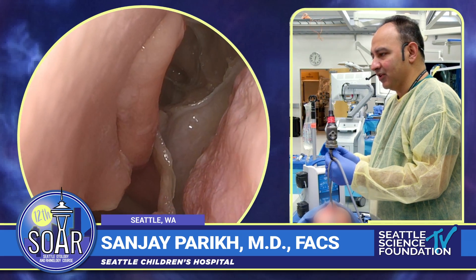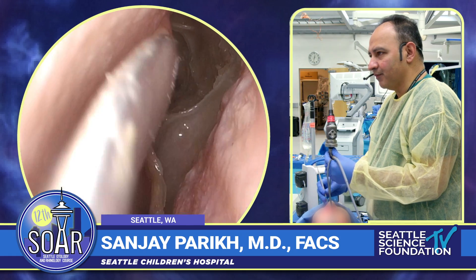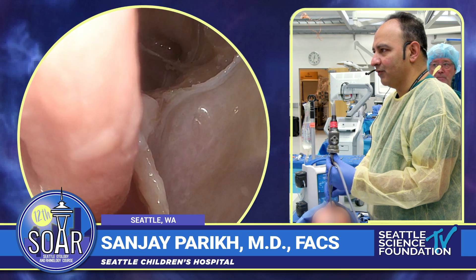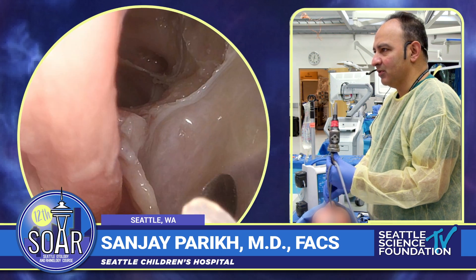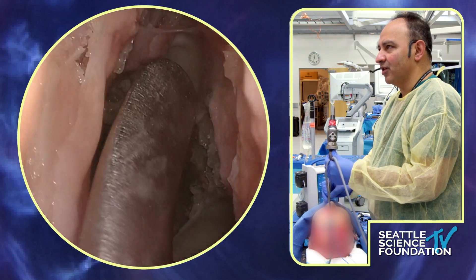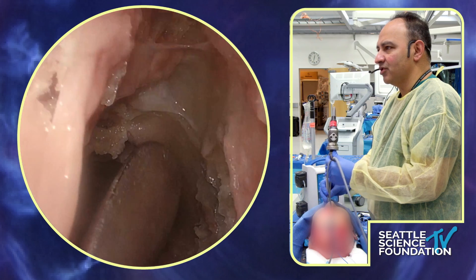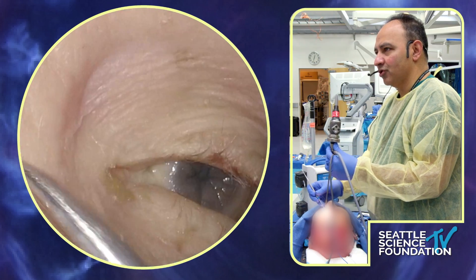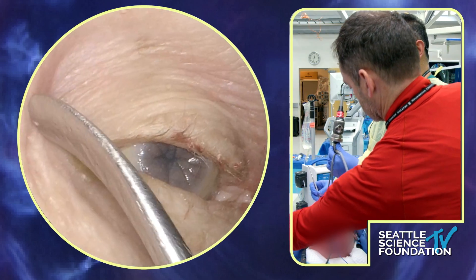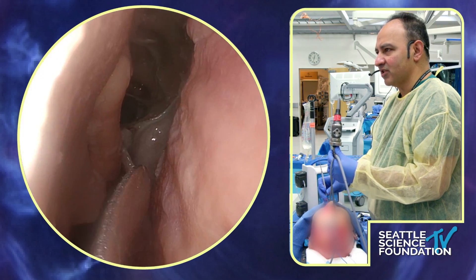Today we're going to be doing a couple of things. I'm going to be working with you on demonstrating the approach to the sphenopalatine artery. Before endoscopes existed, we talked about how to ligate the sphenopalatine artery. Then we're going to talk about the anterior ethmoid artery and see if we can discover it using navigation along the skull base. And then we're going to do an external approach and show landmarking for where to make the incision for an external approach to the anterior ethmoid artery. So let's start by doing some anatomic assessment, some osteology.